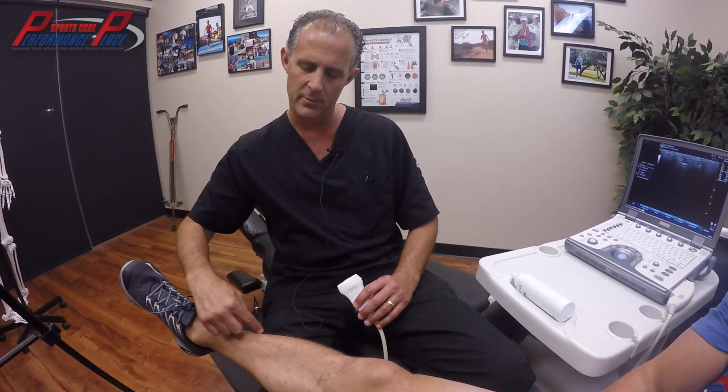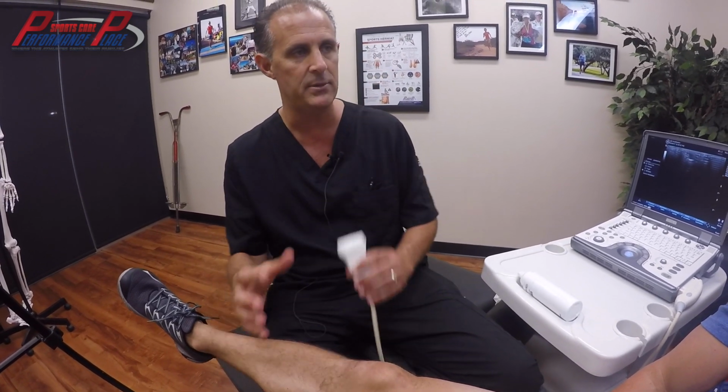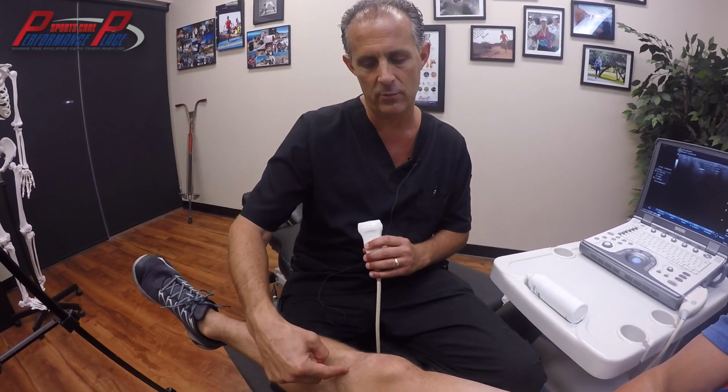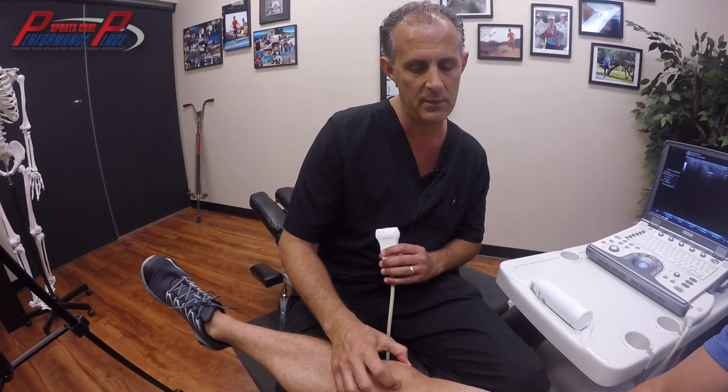So your genu varum, although it's pretty insignificant, if you had real knee problems, we might want to enter this into the mix. Maybe there's an imbalance going on somehow that's causing an overload to the IT band, that's causing an overload to the pes anserine bursa, or even contributing to what we think is a patellofemoral syndrome.